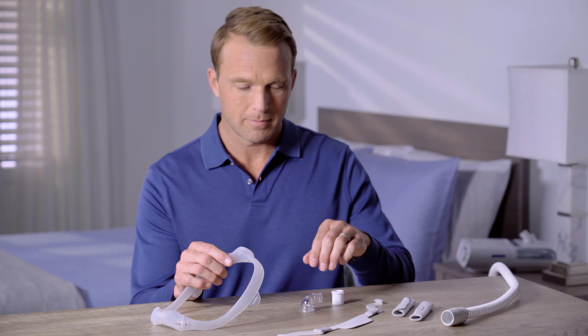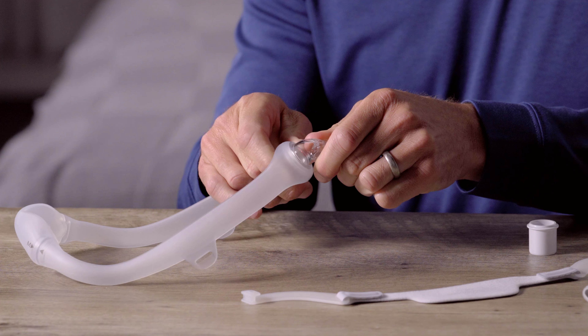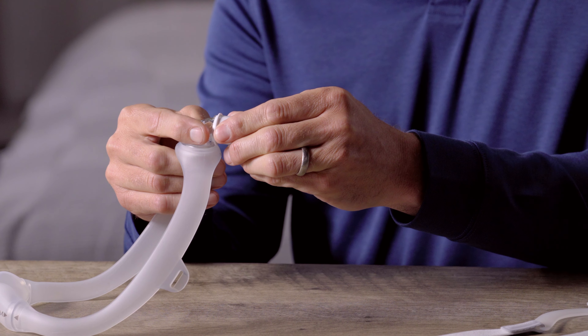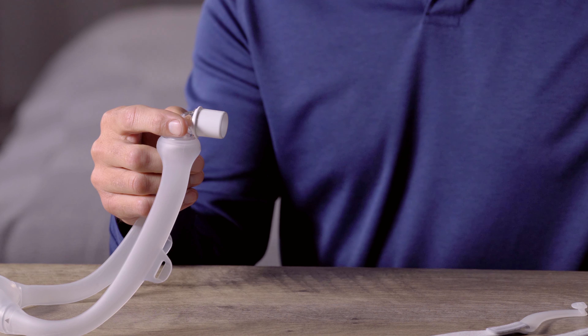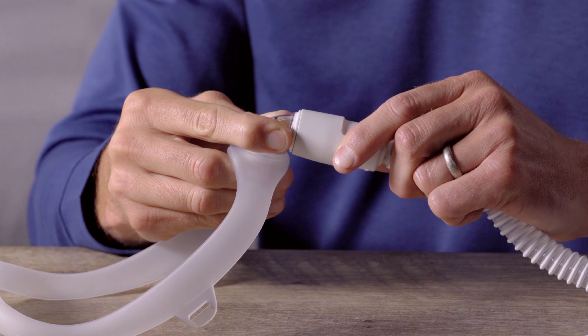Insert the elbow into the mask frame. Push the tubing quick release into the elbow. The quick release lets you easily disconnect the tube, which is helpful if you get up to use the bathroom during the night.